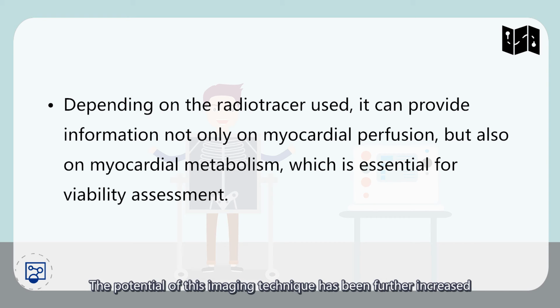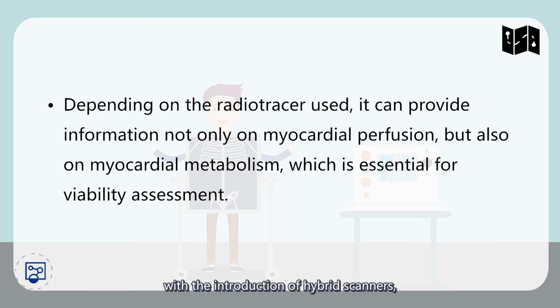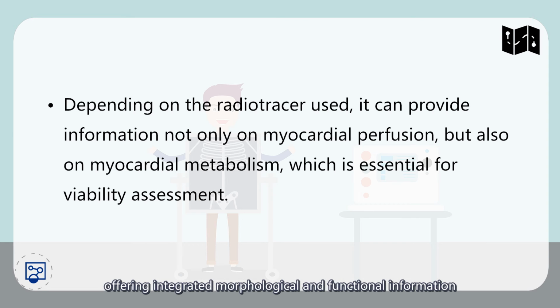The potential of this imaging technique has been further increased with the introduction of hybrid scanners, which combine PET with CT, or cardiac magnetic resonance imaging, MR, offering integrated morphological and functional information and hence comprehensive assessment of the effect of atherosclerosis on the myocardium.